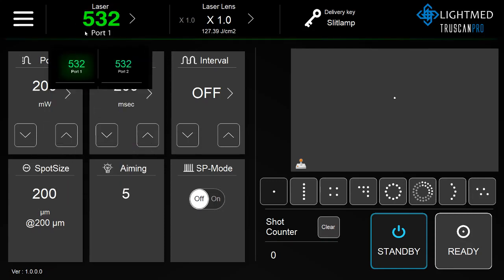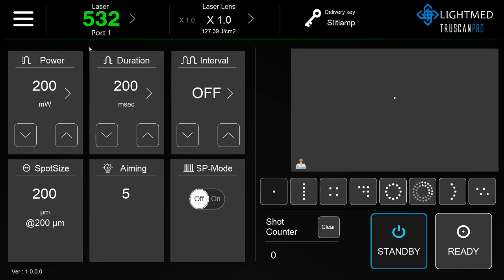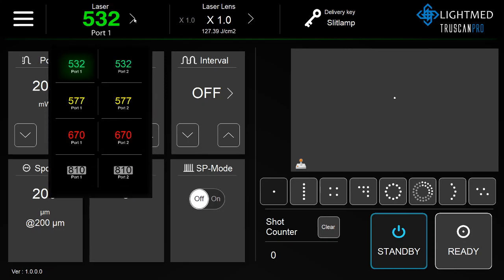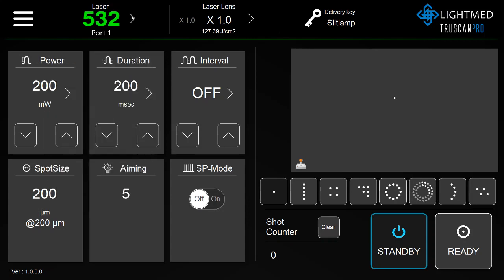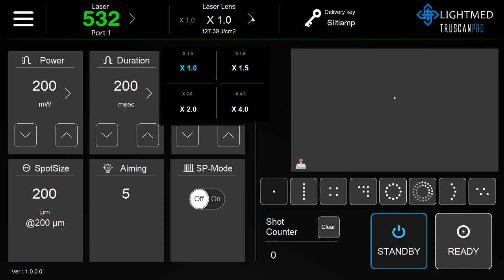Port 1 will always be connected to the slit lamp delivery device, indicated here. Port 2 will be connected to the laser indirect ophthalmoscope or an endoprobe. You can select the laser lens by the right arrow and selecting on the presets.